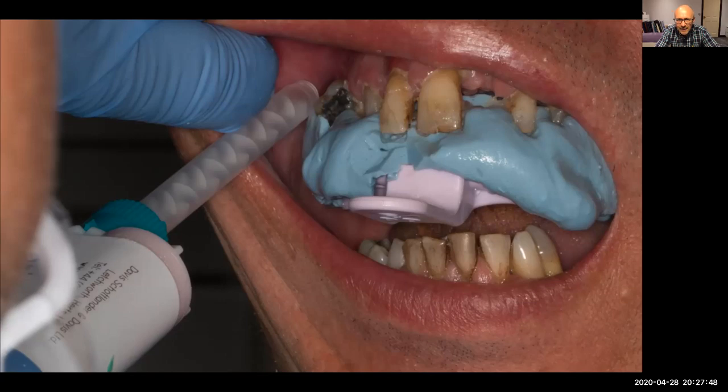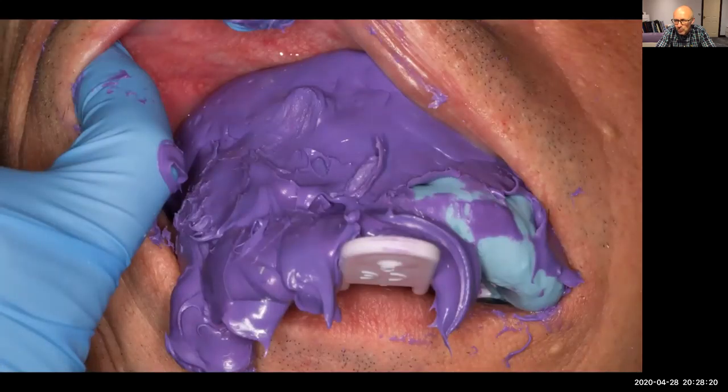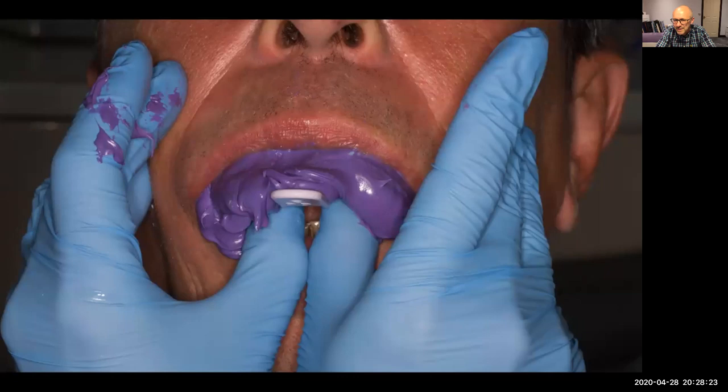I've got some heavy-bodied silicone impression material in a mixing gun. So this is called Doric Heavy. It's a heavy-bodied silicone impression material which I squirt into the sulcus. I've made sure, though, prior to that, that the tray with the alginate is fully seated back in place. I've got to push it up with my finger properly. So I feed this into the sulcus all the way round, using plenty of it.